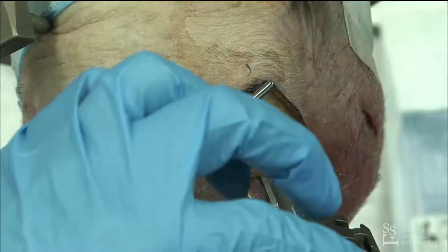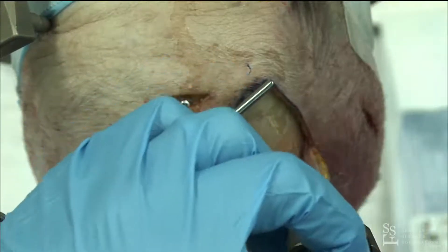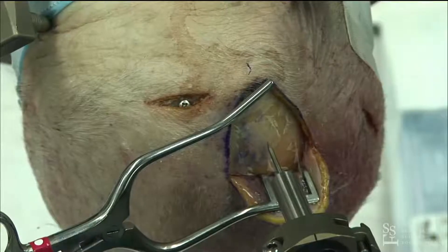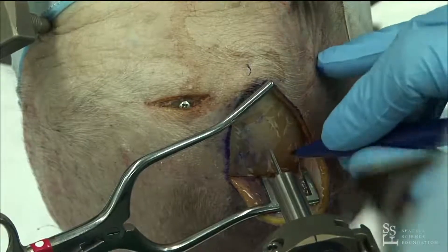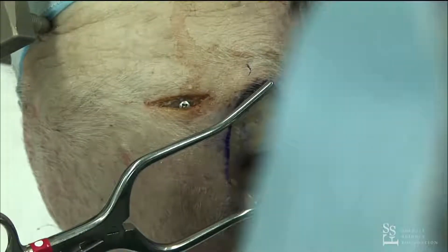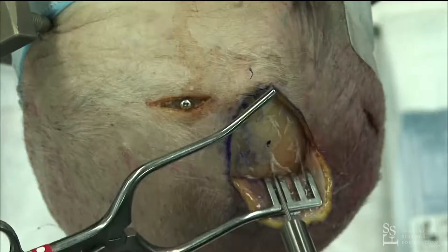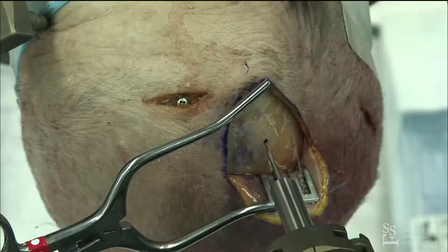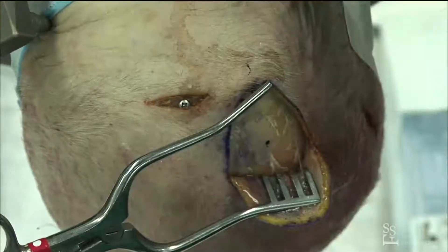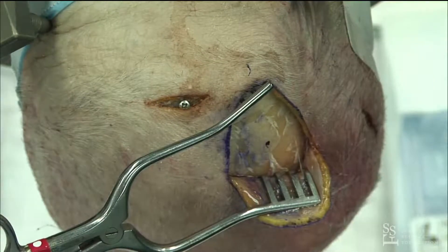I'll use our sharp tip stylet again to re-mark the entry point. And this is where I might want to wear a mask.